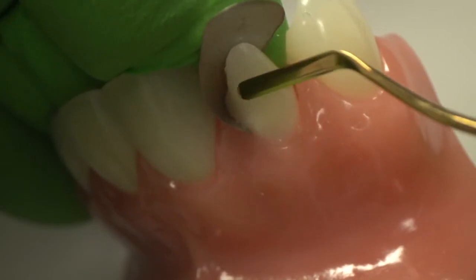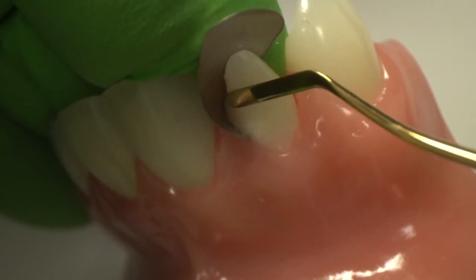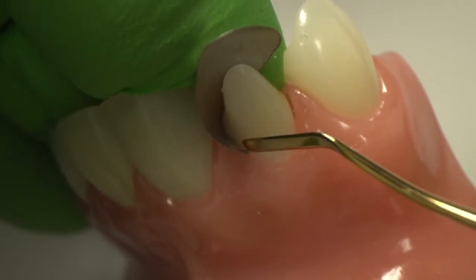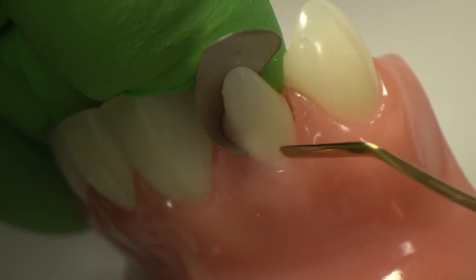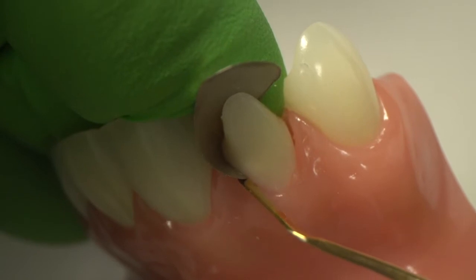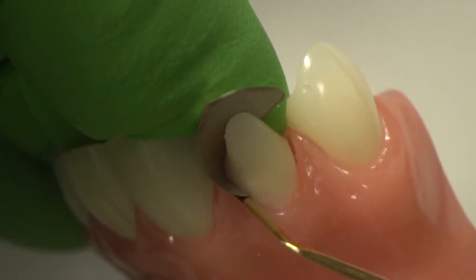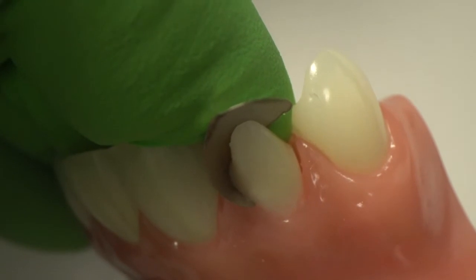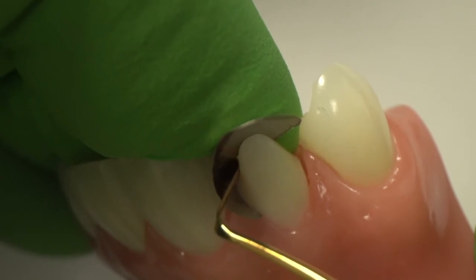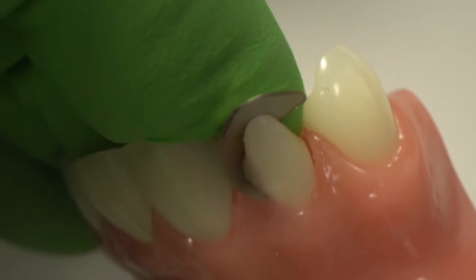At this point, I want to make sure that this is blended in smoothly. It's only a couple millimeters tall, nowhere near towards creating the contact. This is just to establish that subgingival emergent profile. If I need, I can support the matrix band with an instrument while my dental assistant cures. You also want to come in with your instrument and try to seal off to the lingual, get that as sealed as possible. We're going to do a brief cure in a moment.